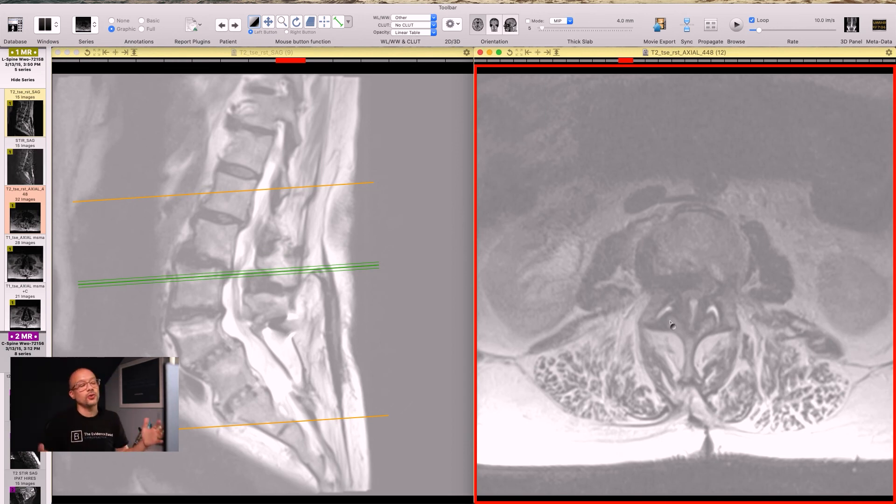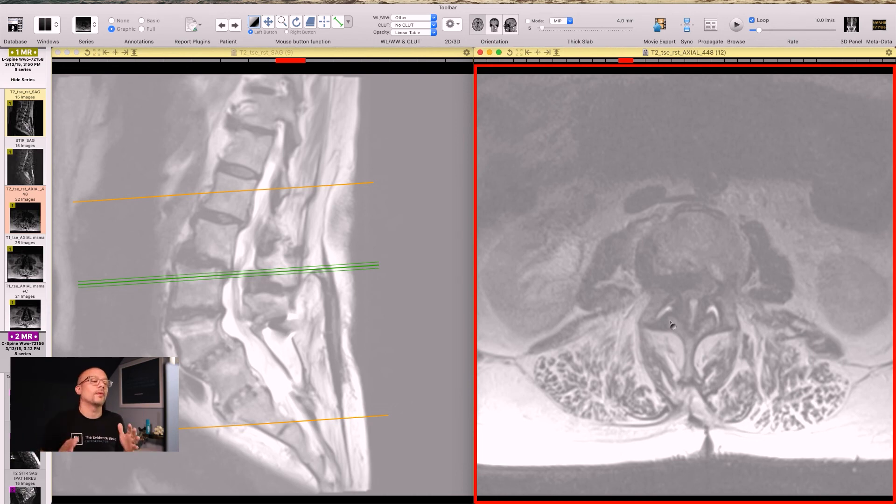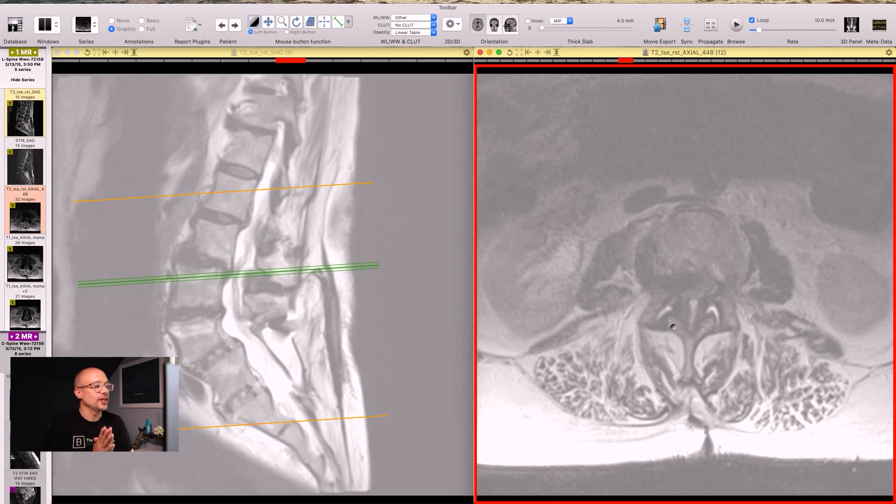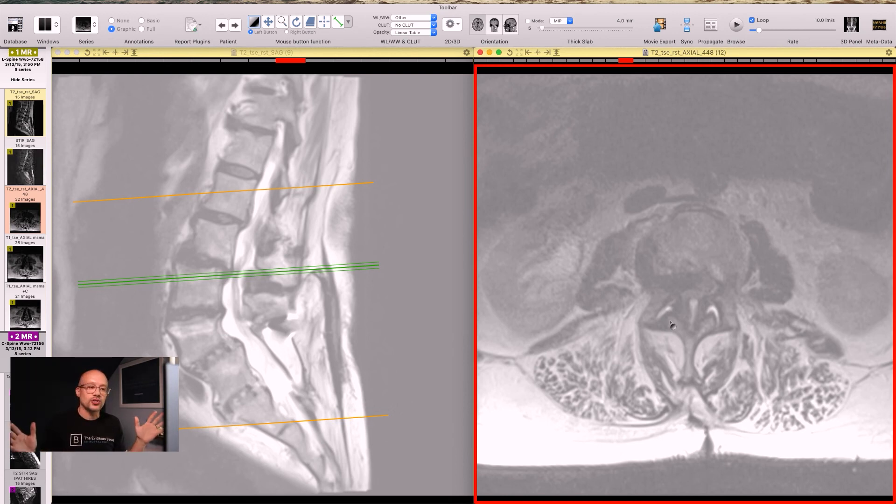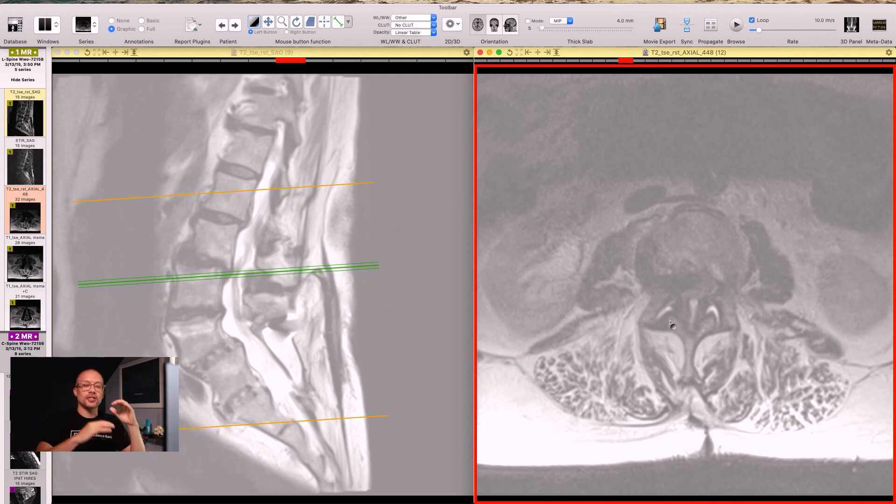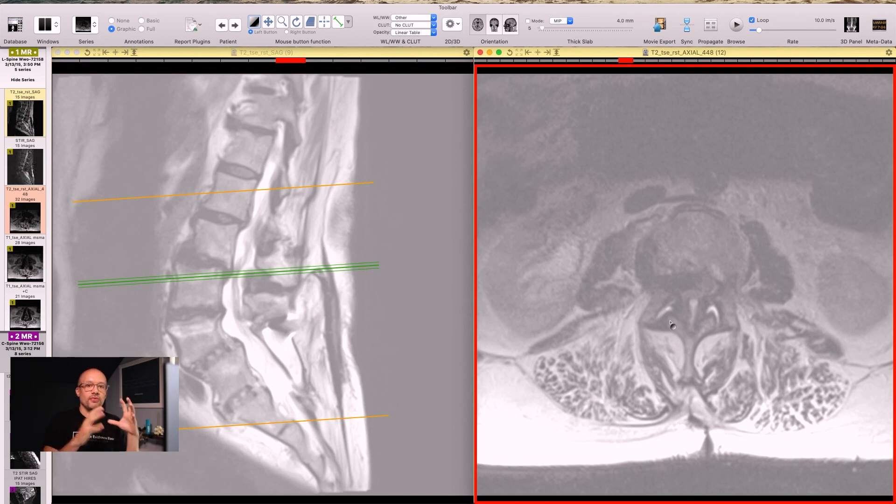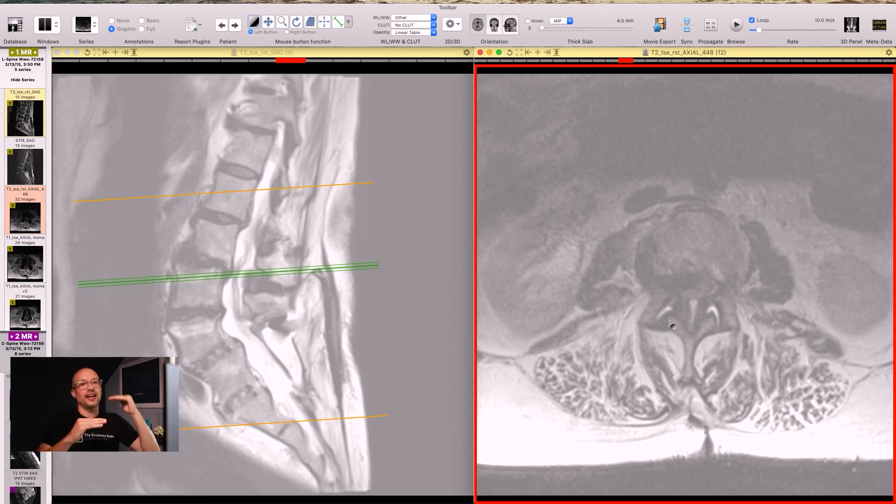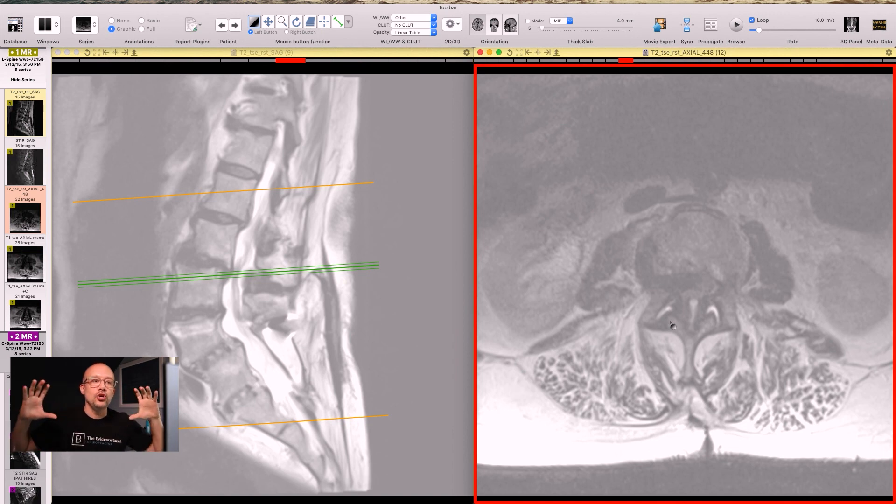So this individual, they have probably had previous back pain for a long period of time because we can clearly see that this individual had a multi-level fusion. Now with that fusion, unfortunately, it's L4, L5, S1. With that fusion, it resulted in a pretty large fluid collection, which might not be the source of the issue, but we can see up above, now there's that cascade effect. It starts to stabilize and secure and fuse one level. If it's additional stress and strain on the levels above, that's exactly what's happening right here. We see at L3, L4, and more importantly L2, L3, a huge pinch or compression on the spinal cord.